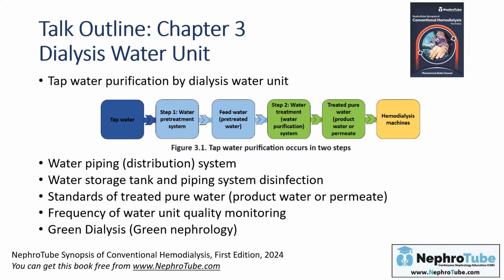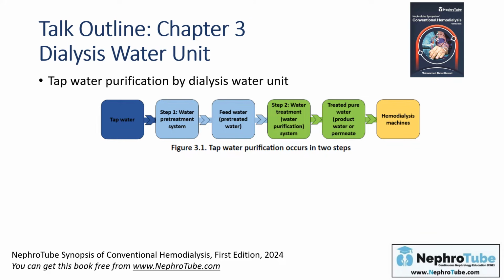After this introduction, I will start my lecture, and this is my talk outline. I will start with how we purify tap water. Then I will talk about the water piping system, and then disinfection, then the standards of treated pure water, and the frequency of quality monitoring of the water, and finally what is called green dialysis.